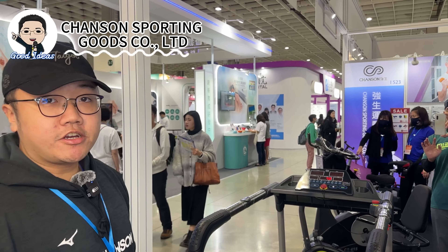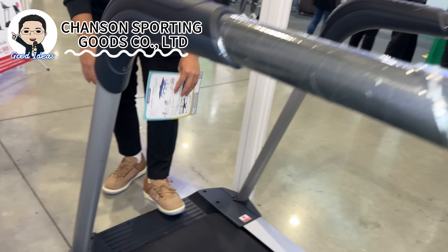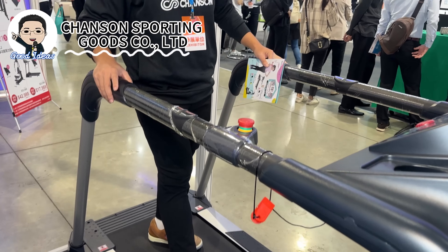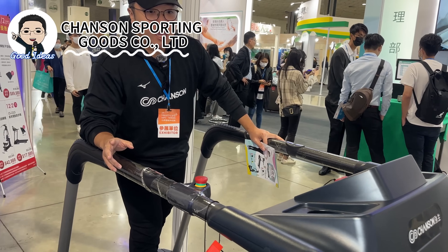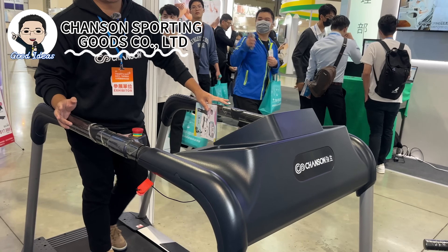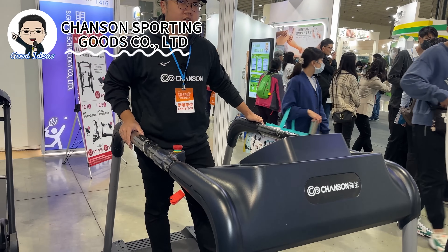What we have here is our treadmill, which is a really unique treadmill. The board is really low and the handle is really long. The design is for elderly people who probably cannot move well and might stumble, so they can use their hands to walk up to the treadmill safely.